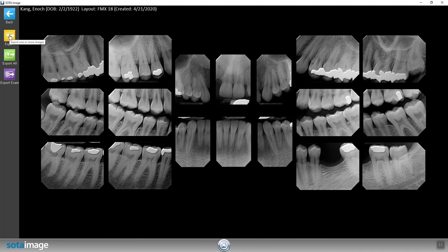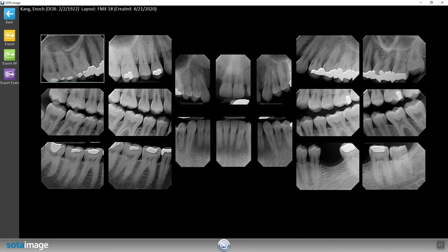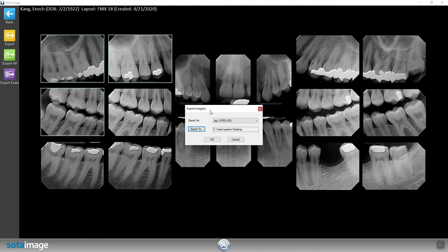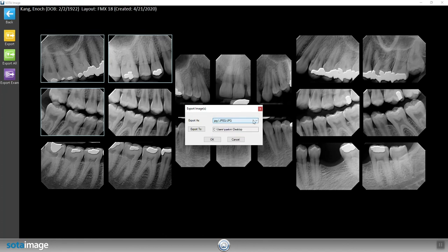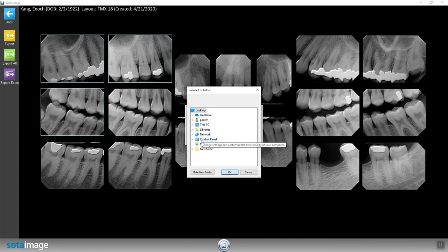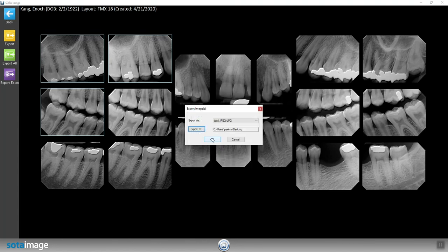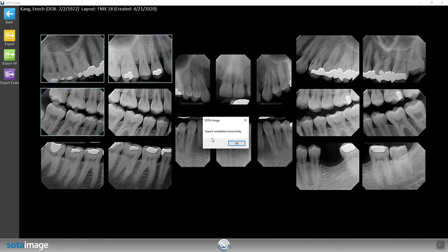Now if you hit the yellow export button, you will be warned to select an image. Select the desired number of images and hit the yellow export button. As a default type, JPEG is selected, but you can change the format to your needs. And as a default location, the desktop is selected, but you can select your own destination. Once you hit OK, you'll be prompted that the export completed successfully.